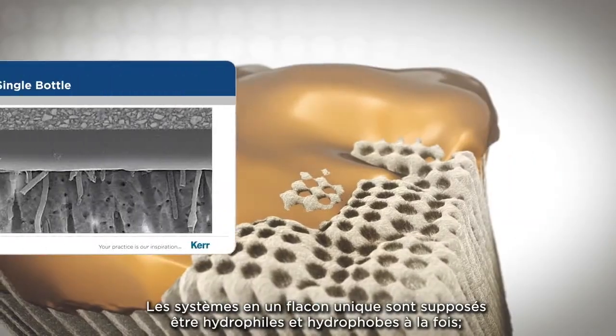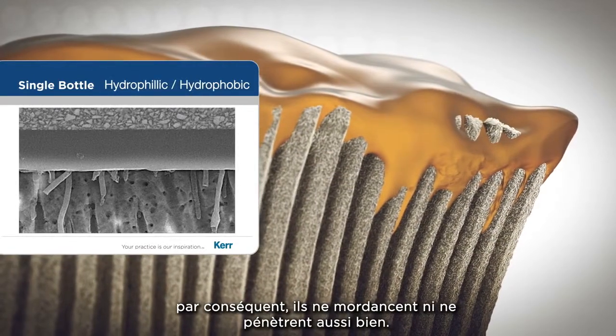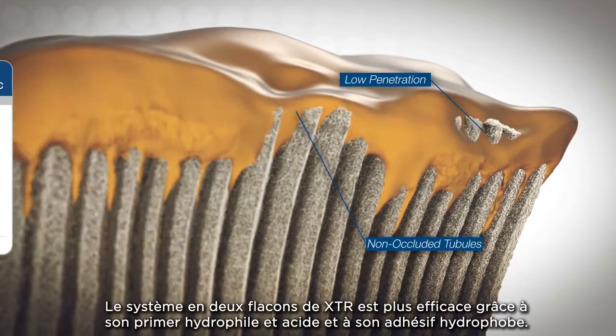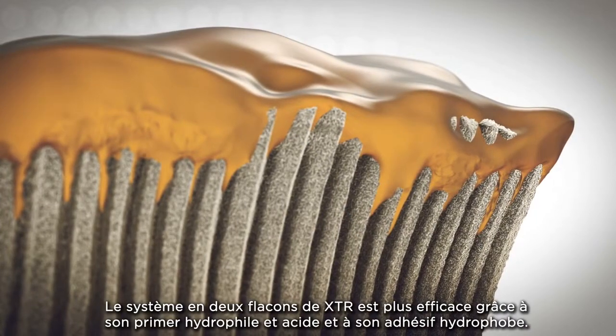Single-bottle systems try to be both hydrophilic and hydrophobic at the same time, and therefore do not etch or penetrate as well. XTR's two-bottle system is more effective with its hydrophilic acidic primer and its hydrophobic adhesive.